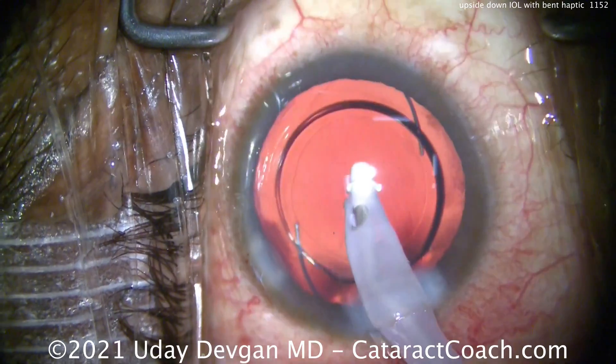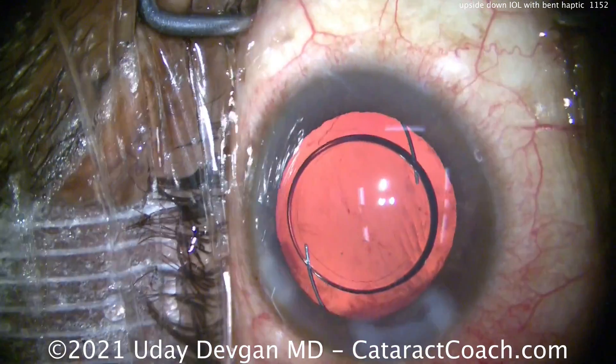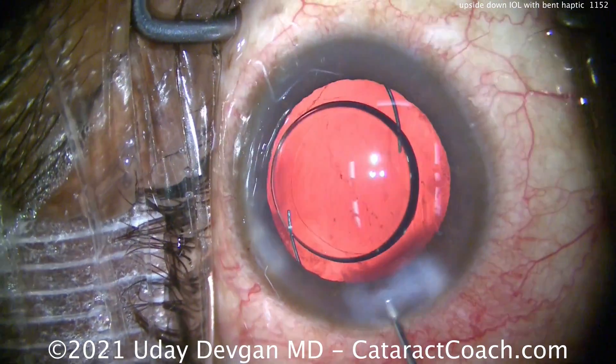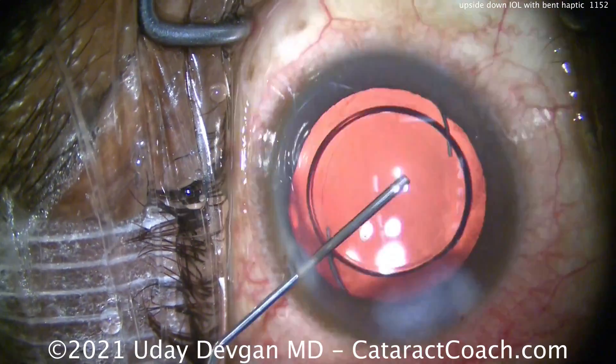We'll finish up here, take out the viscoelastic, and it'll be a really nice outcome for this patient. The patient's going to be really happy. We all have these situations — the key is to be able to deal with it on the spot.